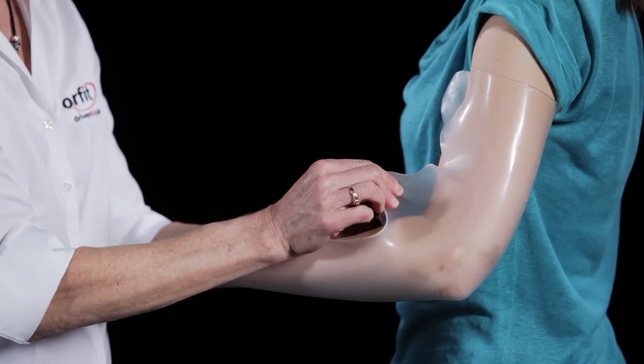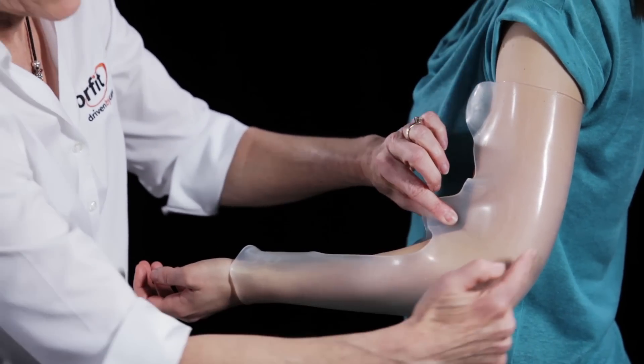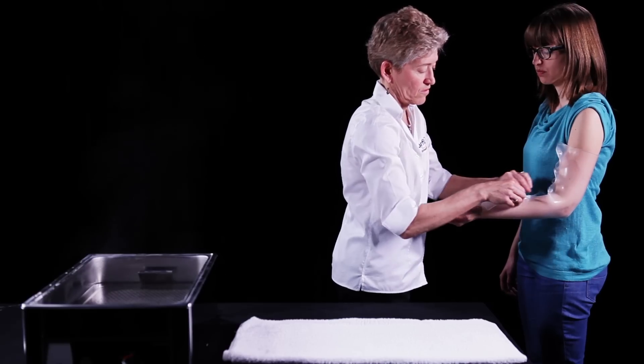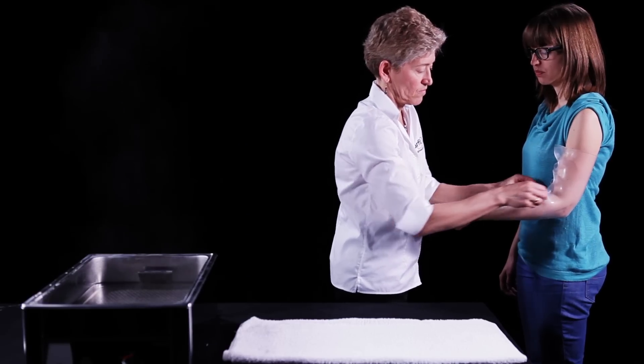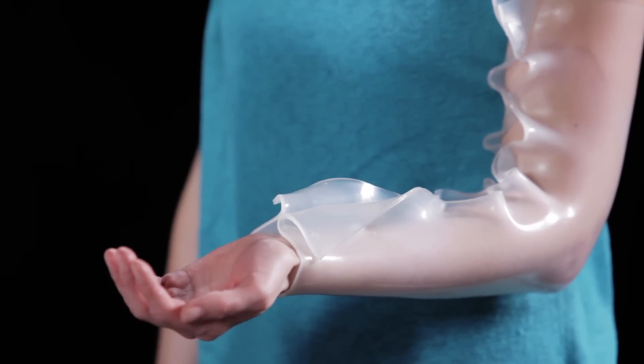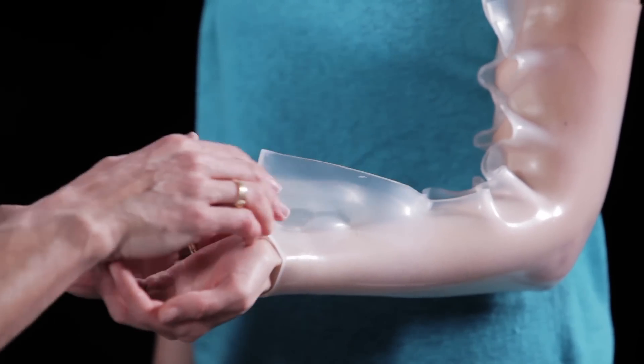Lastly, gather the material from both sides of the elbow and stretch it to meet together on the volar cubital fossa. This allows the material to conform to the patient's anatomy. Add additional pinches along the volar opening as needed to secure the material together.